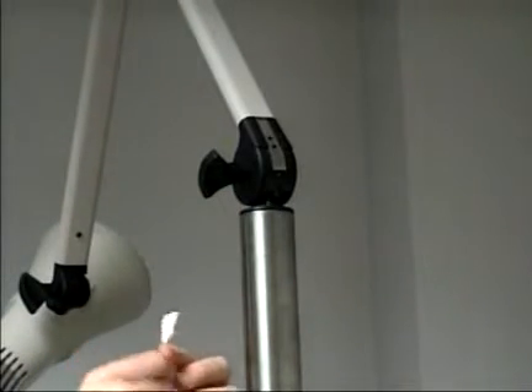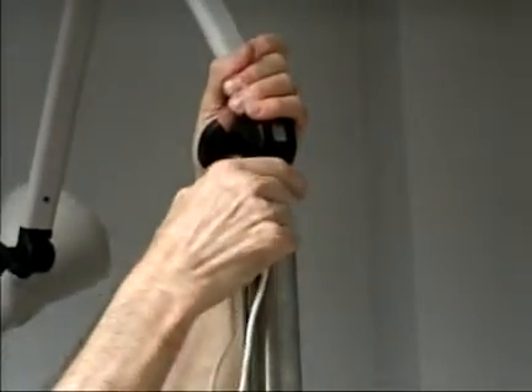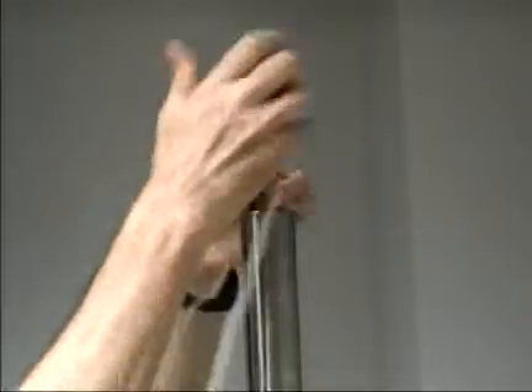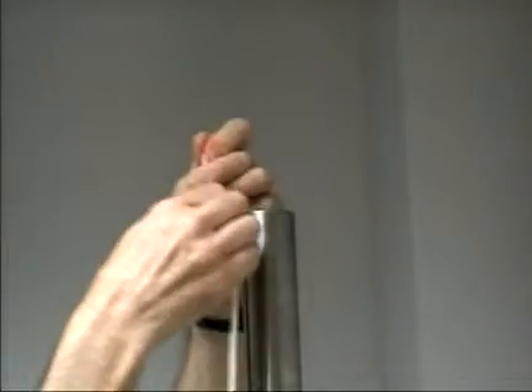The other step in removing this light is you need to separate the internal wire. It snaps together, and to keep from losing it inside the pole, you need to have a long cord to make sure it's not lost.